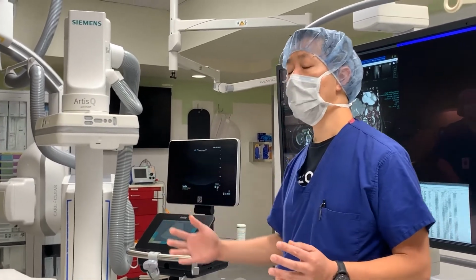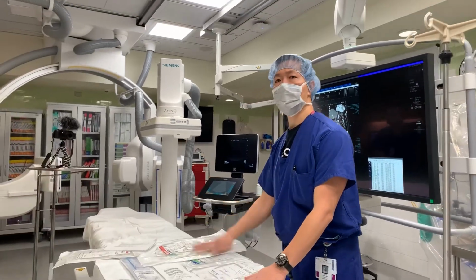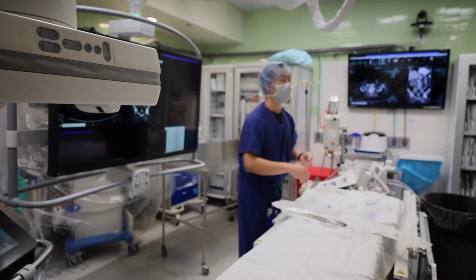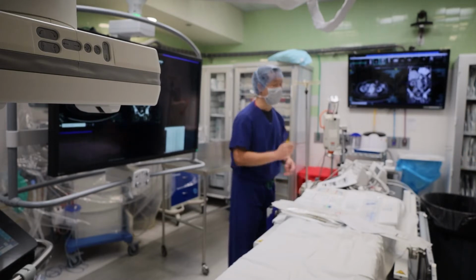Okay. All right. So before we talk about supplies, what are the steps of a perc neph? Jake, first step of a perc neph. Lido, ultrasound, access, wire, introducer, 035 wire, perc neph. Okay, fine. So those were all the steps. Good job.